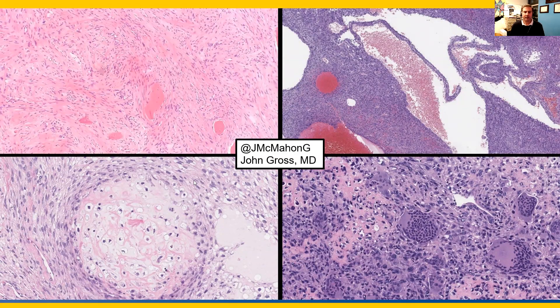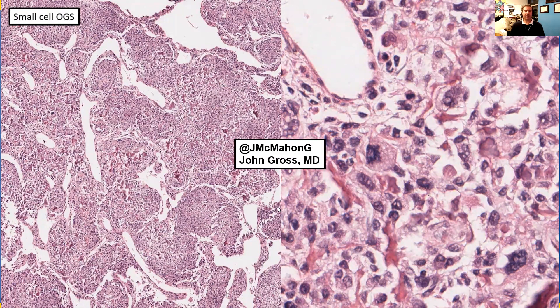The bottom left is an example of chondroblastic osteosarcoma — a nodule of cartilage with a little osteoid formation. In the bottom right, an example of giant cell-rich osteosarcoma: pleomorphic tumor cells with osteoid production and large multinucleated giant cells. Here's a view of small cell osteosarcoma on the left — primitive cells directly producing mineralized osteoid; at low power you can see tiny purple spicules. On the right at higher power, you can see these cells producing mineralized osteoid — again, the definition of osteosarcoma.